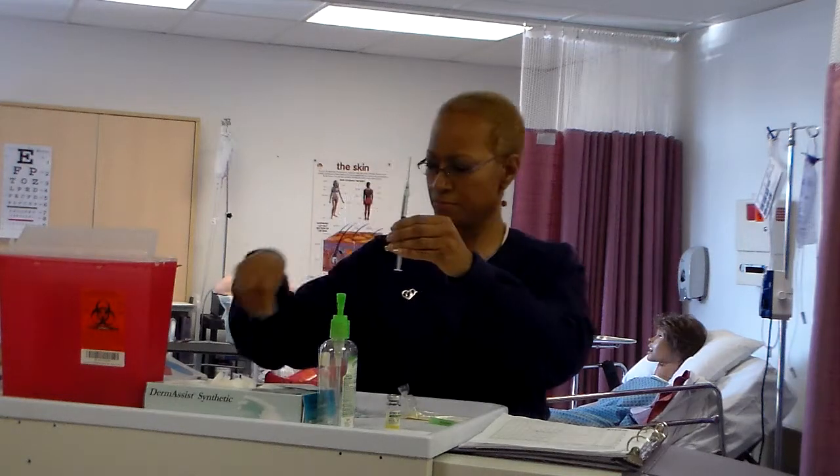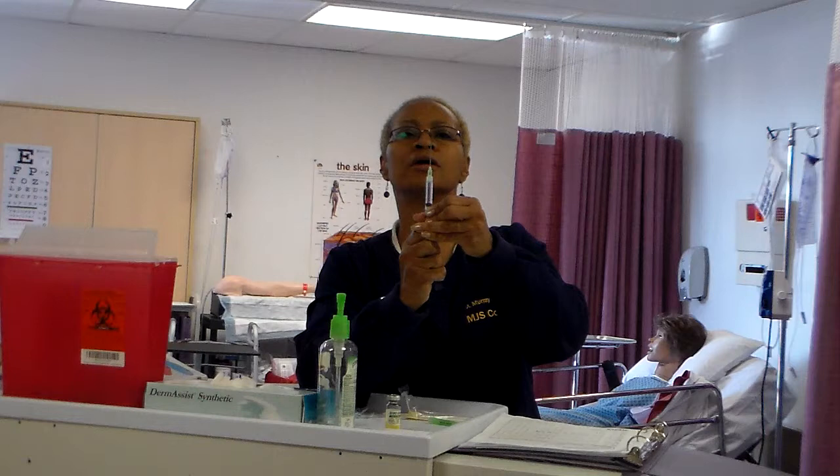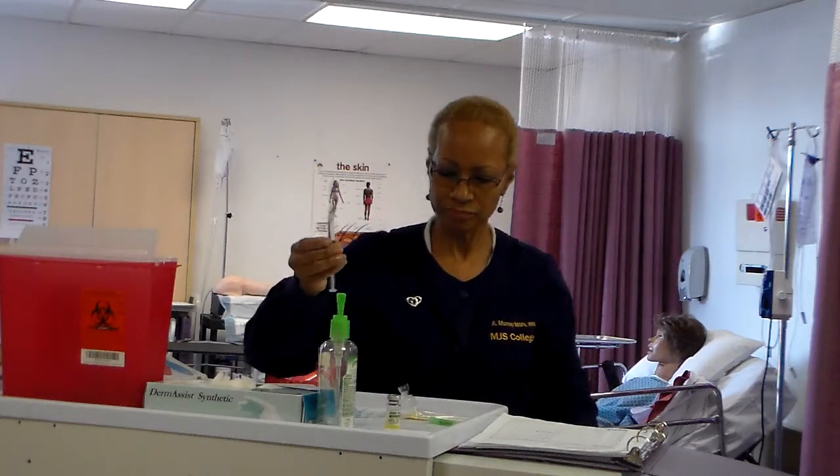Check your syringe and make sure that you have all of your bubbles out. If the syringe contains excess fluid, use the sink for disposal. Hold the syringe vertically with the needle tip up and slanted slightly toward the sink. Slowly eject excess fluid into the sink. So this gives me about 1.8 milliliters. If that was more than what I am supposed to deliver with this dose, I would go to the sink, tilt it just a little bit, and remove the excess.